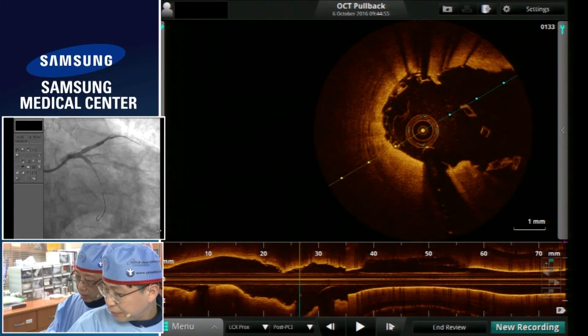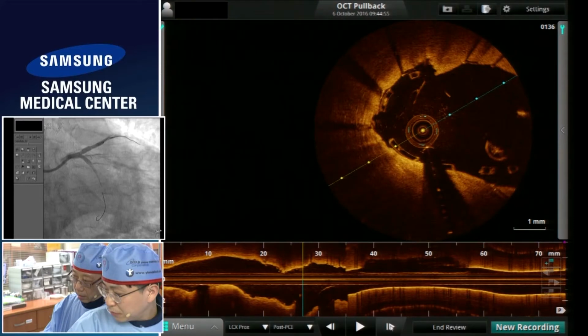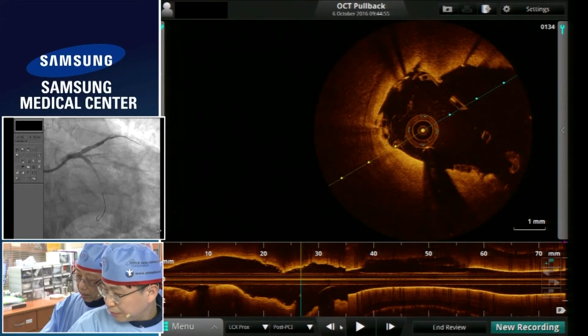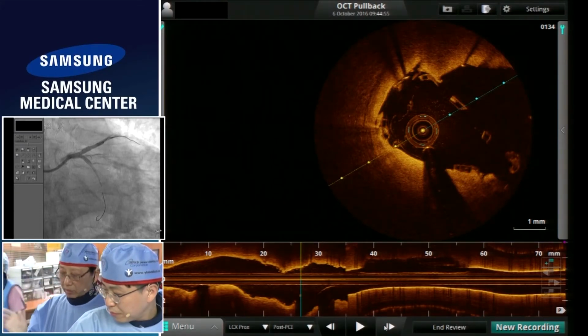Dr. Tegu, how do you tell whether the struts at 2 and 3 o'clock are disrupted architecturally? We always see something like this if we do T-stenting, but as long as the amount of struts protruding to the main vessel is not much, usually it doesn't matter. And the second thing is that because the left main and the side branches are big vessels, it also doesn't matter. Can we go a little bit downstream?